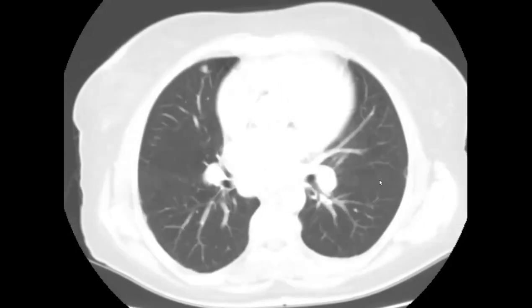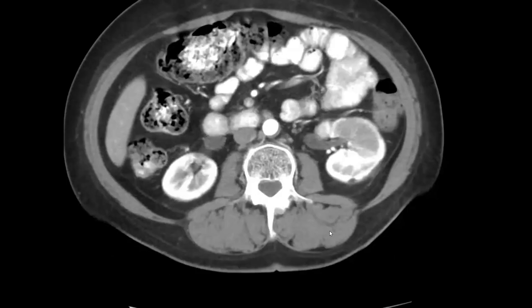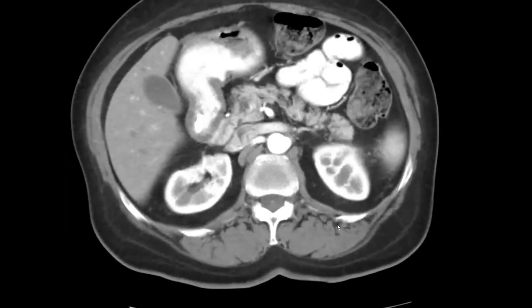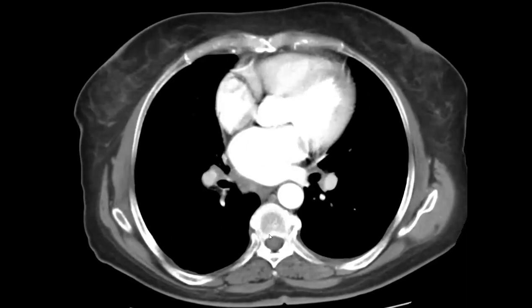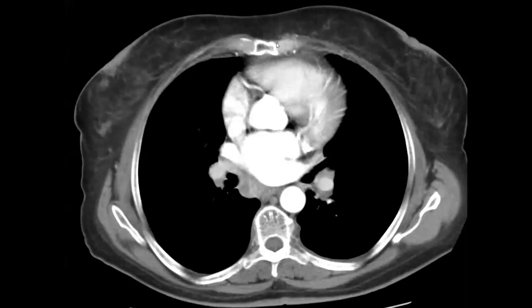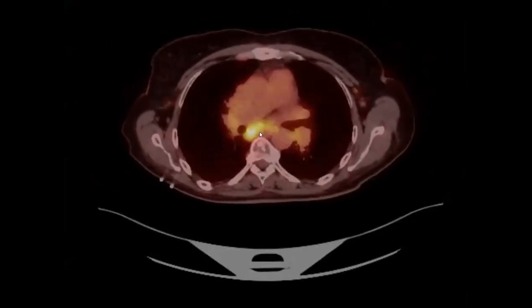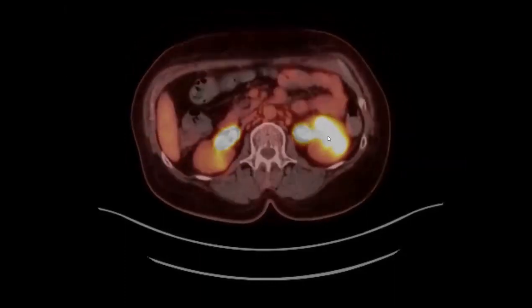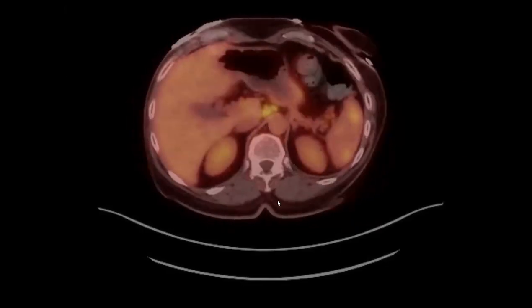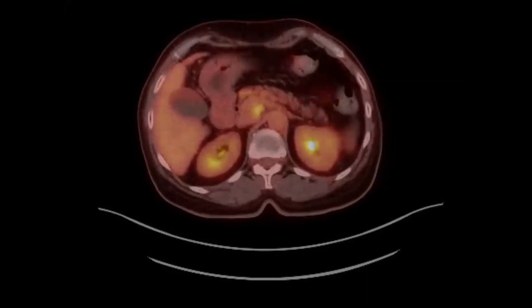About 50 percent of sarcoid patients have splenic or liver involvement — sometimes not visible because it's microscopic, but found on autopsy. Renal involvement is a bit less common at about 15 percent. On PET, the mediastinal nodes, splenic lesions, and renal lesion are all hot — but hot doesn't mean malignant, sarcoid nodes can be hot. Sarcoid treatment depends on stage; when pulmonary fibrosis is present it's harder to treat, but in earlier stages steroids work.